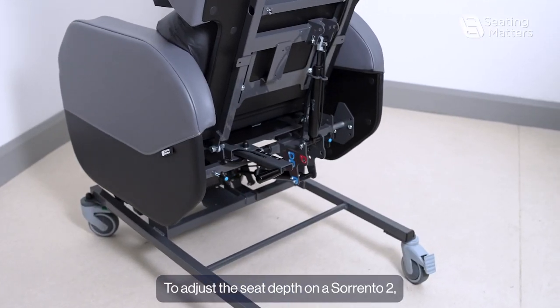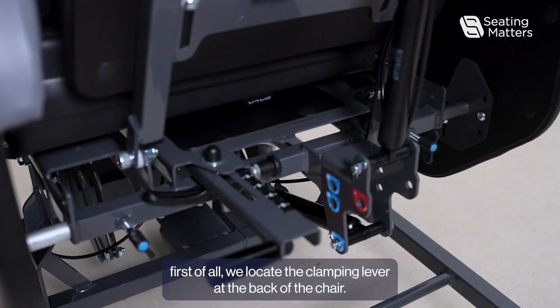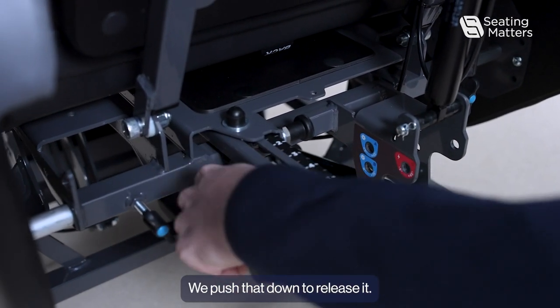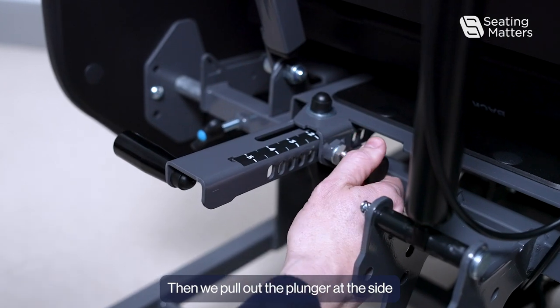To adjust the seat depth on a Sorrento 2, first locate the clamping lever at the back of the chair. Push that down to release it, then pull out the plunger at the side.